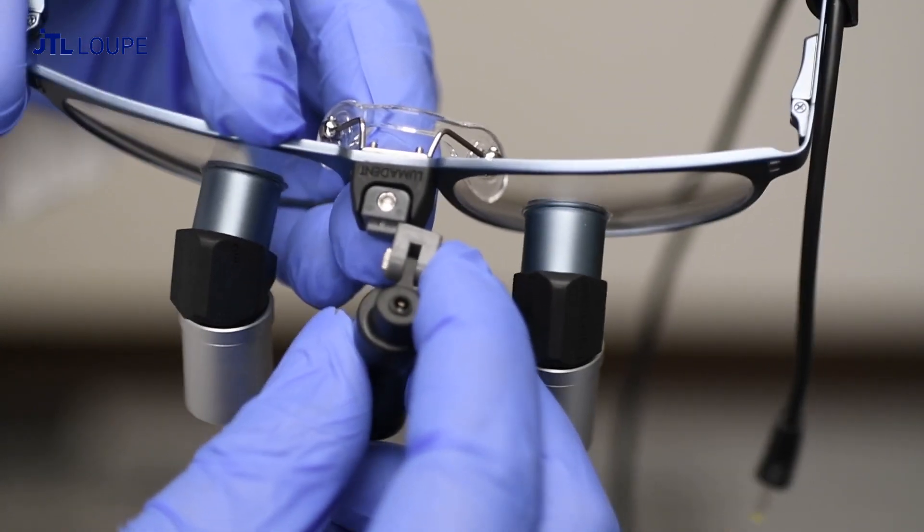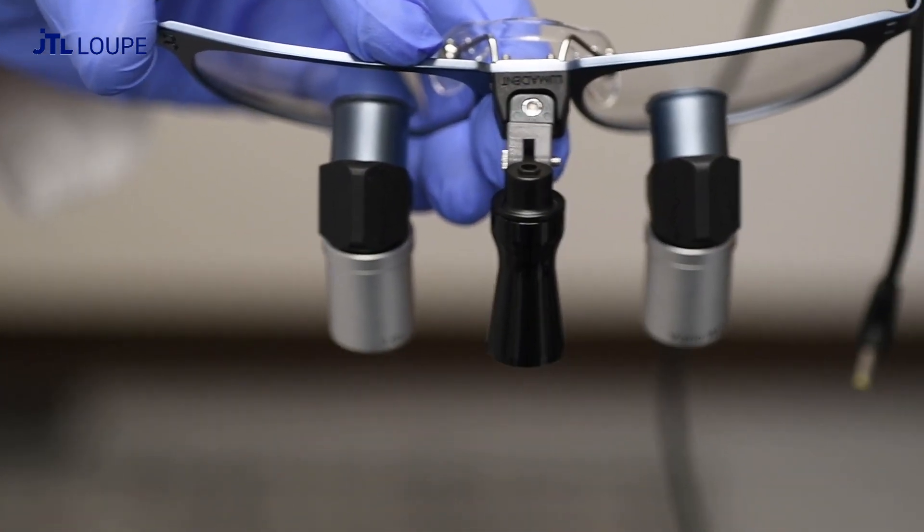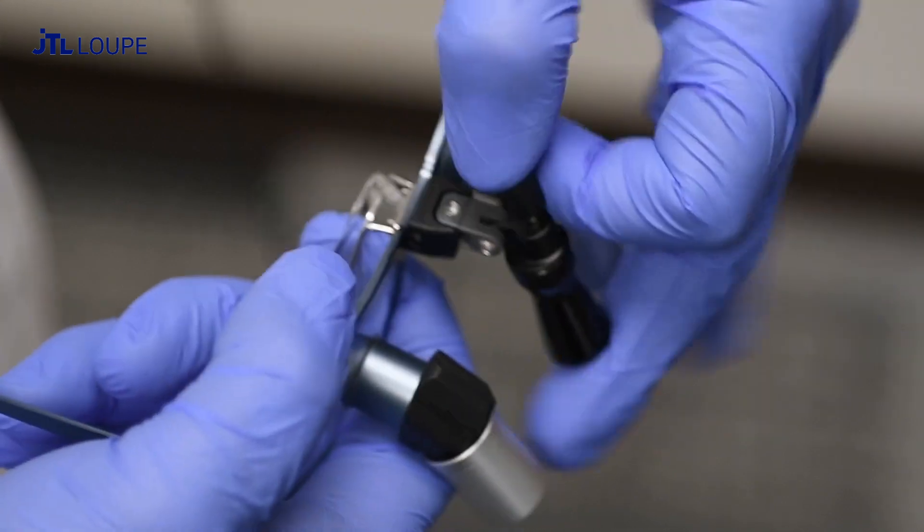Attach the headlight to your frame. Plug the wire into the headlight.